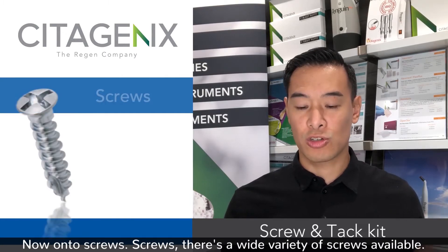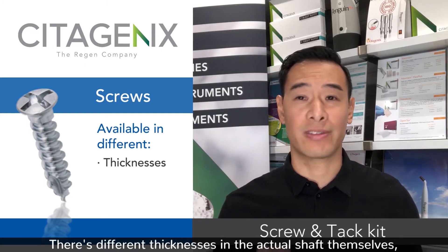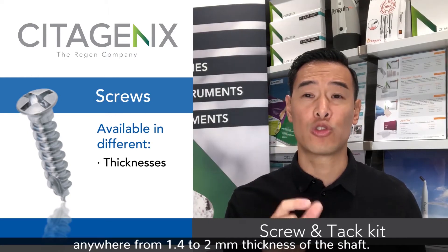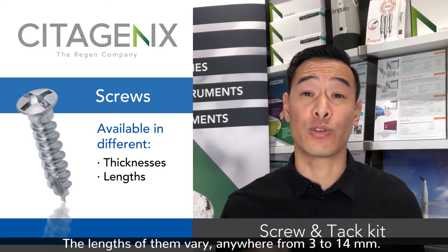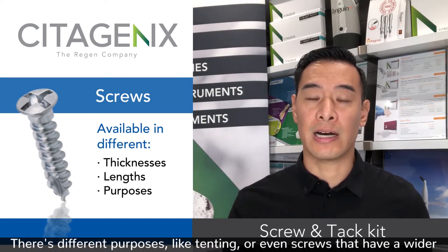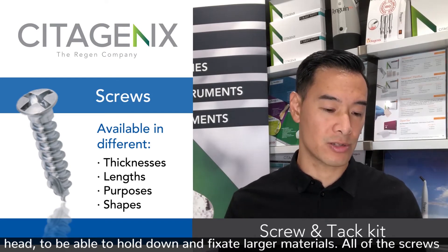Now on to screws. There's a wide variety of screws available. There are different thicknesses in the actual shaft themselves, anywhere from 1.4 to 2 millimeter thickness. The lengths vary anywhere from 3 to 14 millimeters. There are different purposes, like tenting, or even screws that have a wider head to be able to hold down and fixate larger materials.